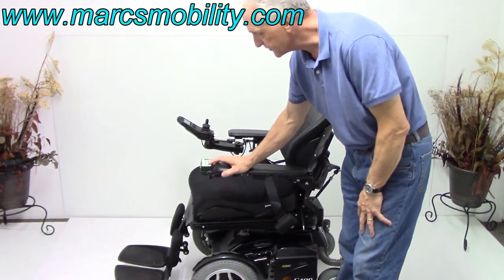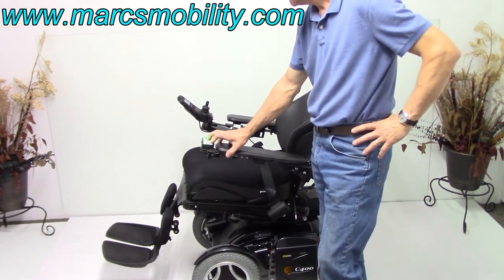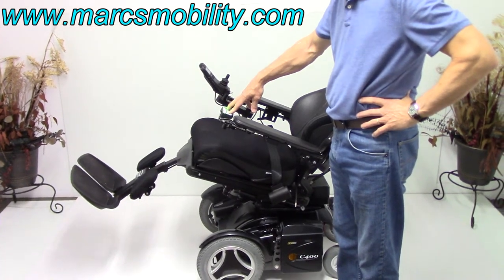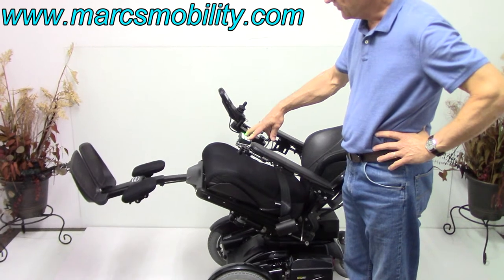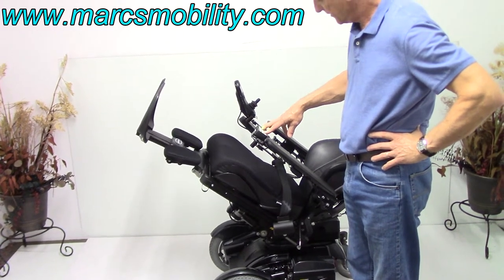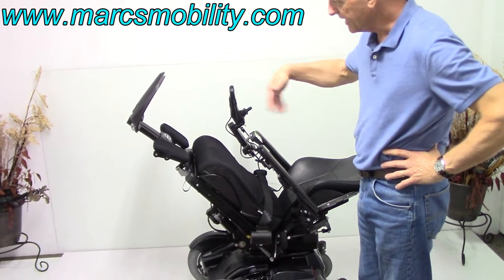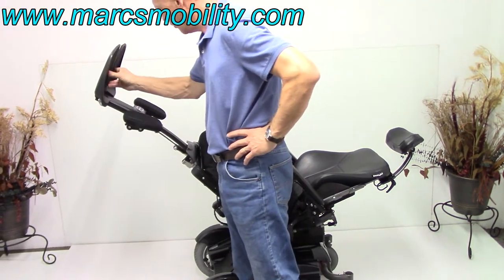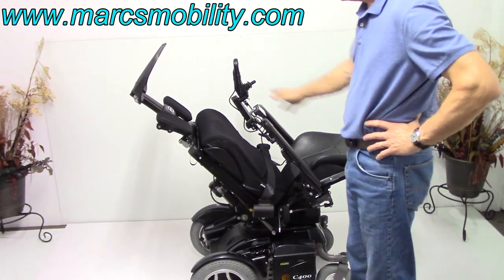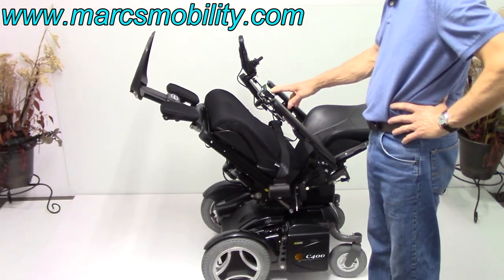The next feature we're going to cover is the electric tilt. I'm going to do the legs also with this one at the same time. So now we've got the tilt going — I'm hitting two buttons. You've got the legs going up and the tilt going back. So if you want to raise your legs higher than your body for circulation, this would be a good way to do it. I'm going to go as high as it'll go — this is considered a full electric tilt. The legs are adjustable and electric; we can make them any length you want depending on your height and what you need. So these are the electric legs and your electric tilt.